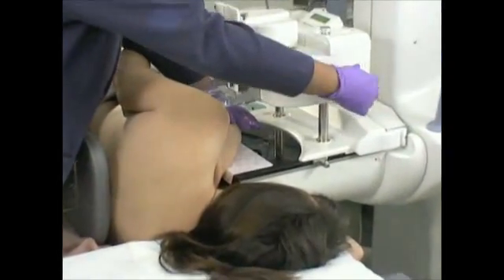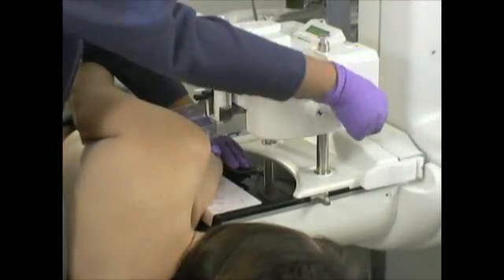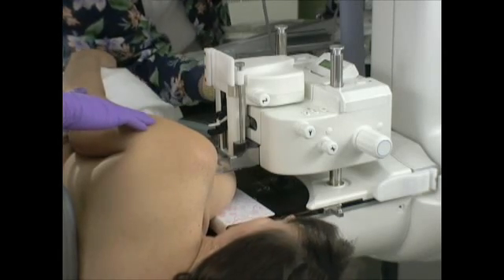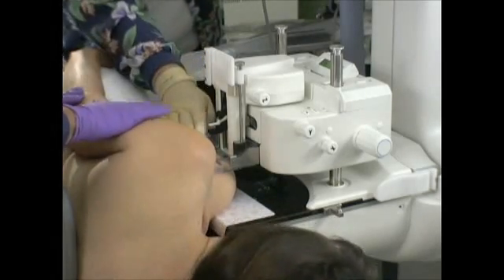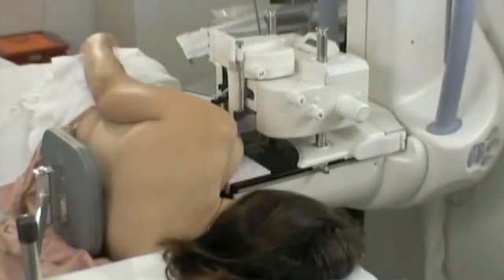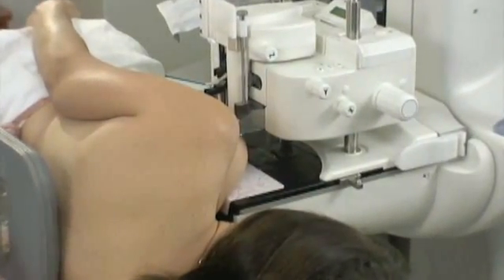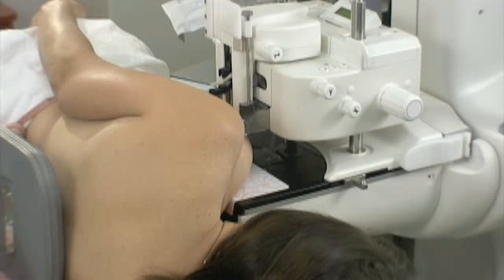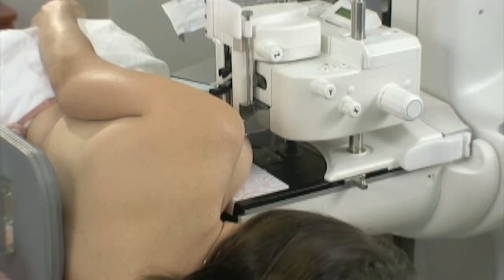We've reviewed the pre-biopsy mammogram and have an idea of where in the breast the calcifications are located for our preliminary targeting pictures. Sometimes it's useful to place a BB marker on the skin prior to bringing the patient into the stereotactic room, as that can help with localization. We're going to take our first scout picture. Our initial scout demonstrated calcifications at the posterior aspect of the biopsy window, so we reposition the patient to place the calcifications more in the center of the biopsy window.